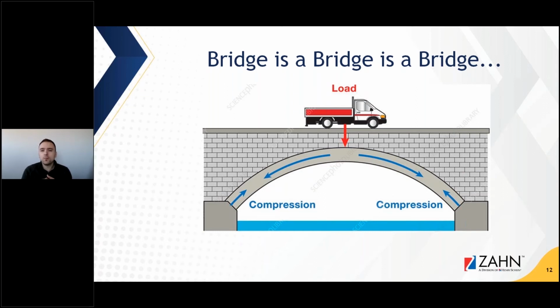It also becomes important depending on the type of material that you use. On PMMA restorations, we actually tend to make that lingual connector even wider because we really need that provisional to last. If it's a surgical provisional, after the surgery, we need it to last a good 6 months.